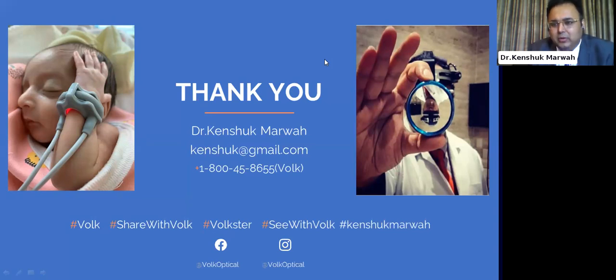You should be able to close one eye and then the other and see through both the eyepieces. Once you are okay with that, take the lens in your hand and try to look at the temporal retina. Just practice that part only. Don't start with charting the whole 360 degrees.